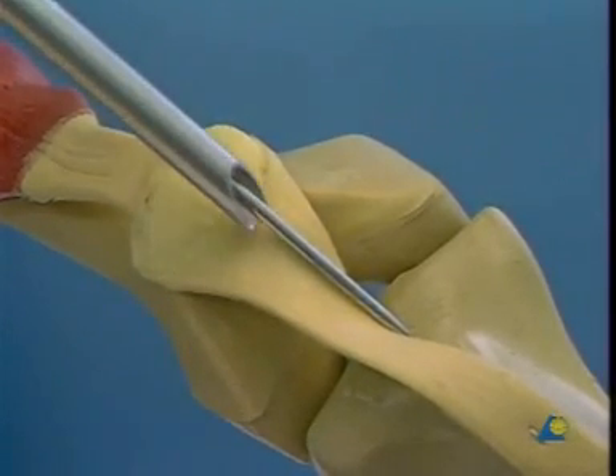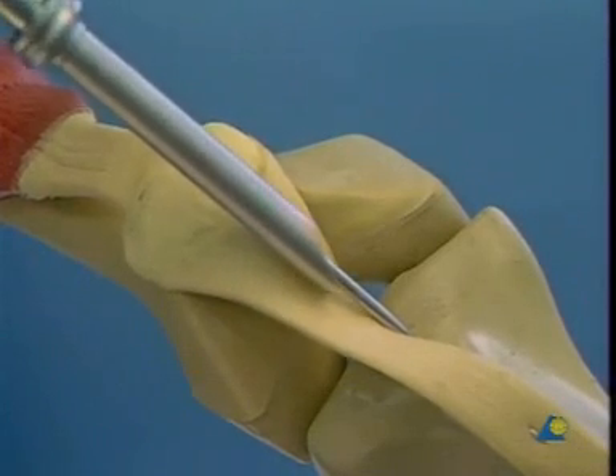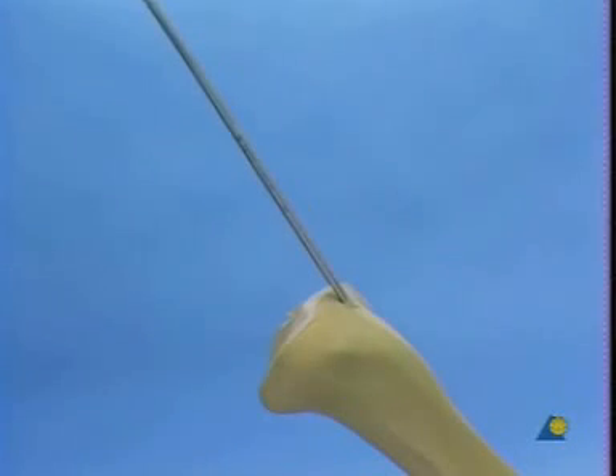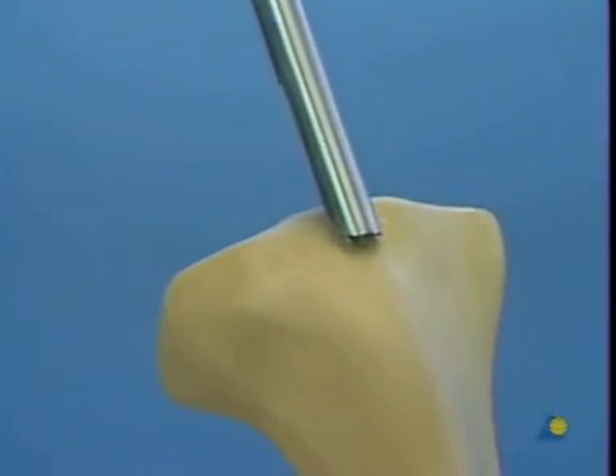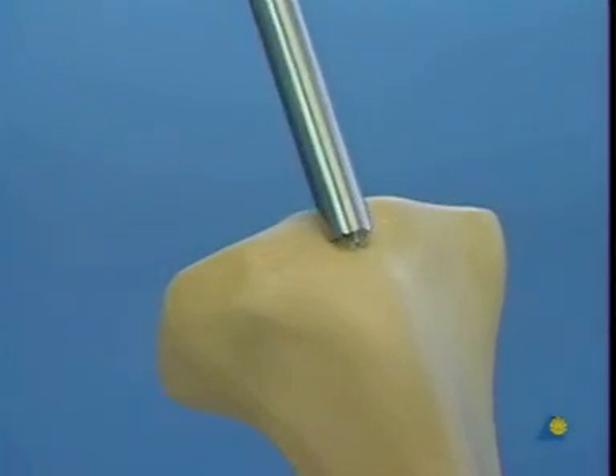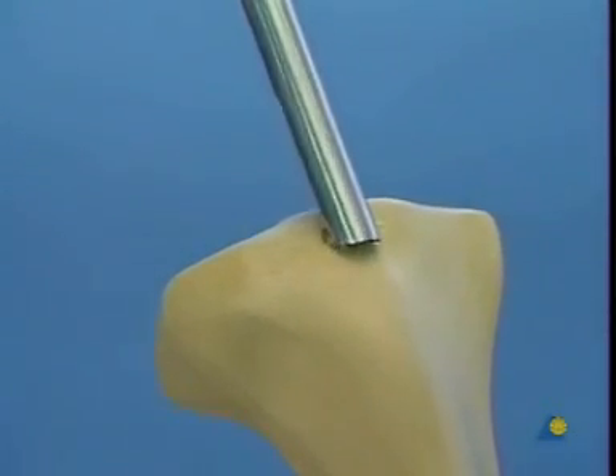The protector also protects the surgeon from the cutting edges of the instrument. On the model, we have deliberately pulled the protector back in order to show the cutting instrument being turned gently, and thus cutting through the cortex and entering the medullary canal.